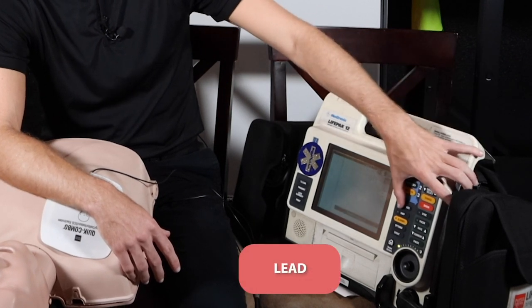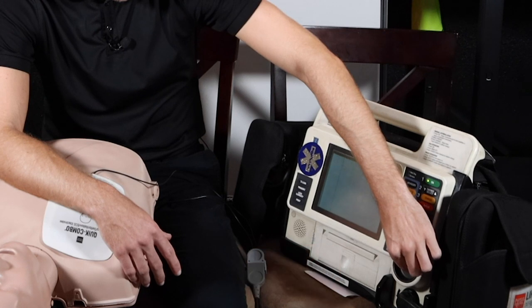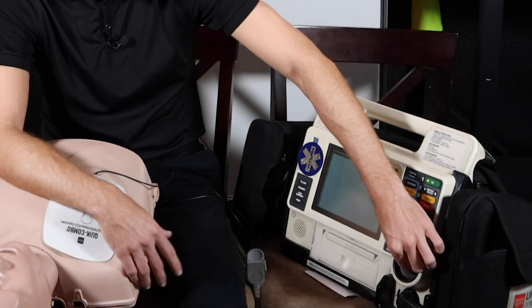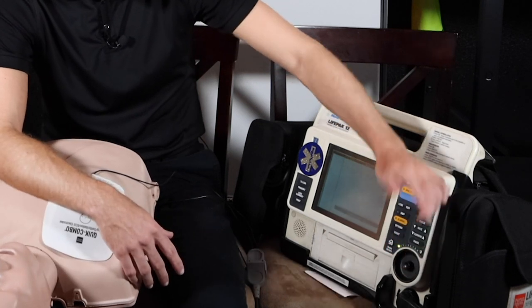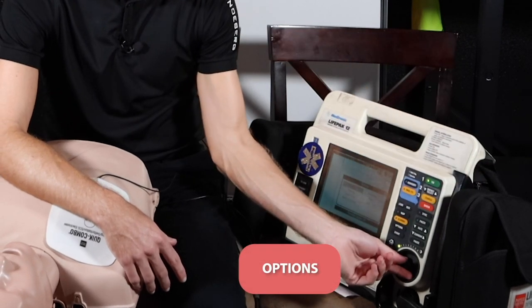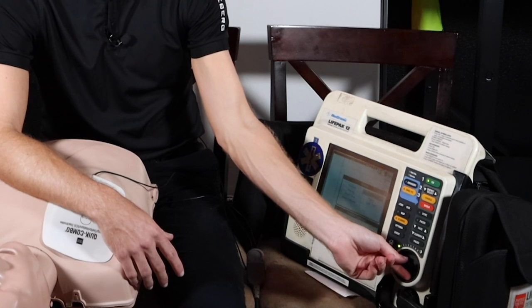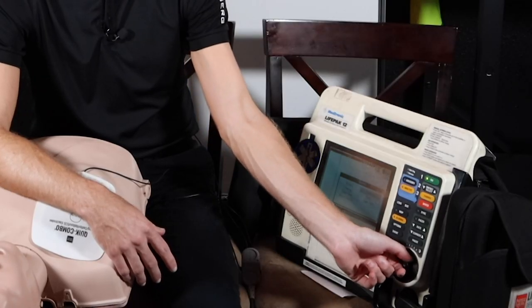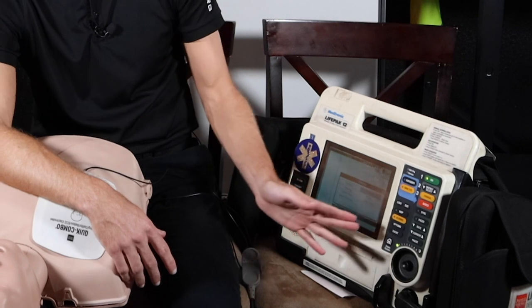By hitting lead, I can go here and actually check out different leads and different views of the heart. Now the last thing here that we have is options. So in the options tab we can see other patients, we can go back to patient archives, we can do an actual user test of the device itself — which is pretty cool. We can change the date and time, all that good stuff. Over in options, you can play around with that.